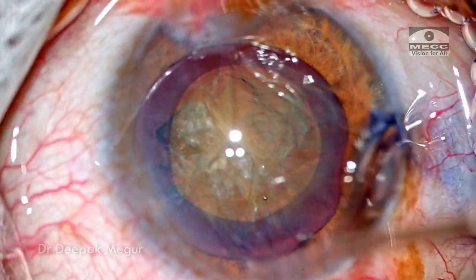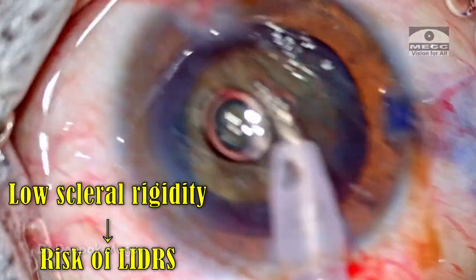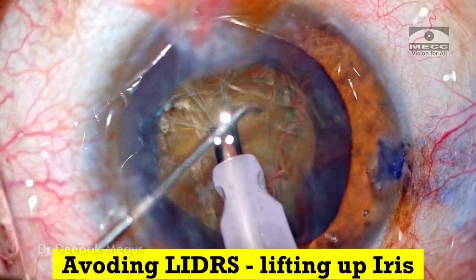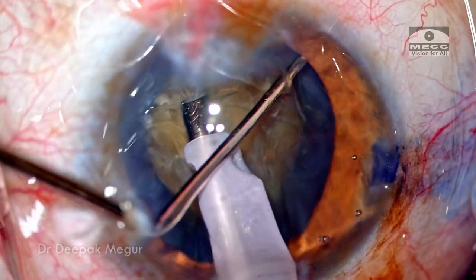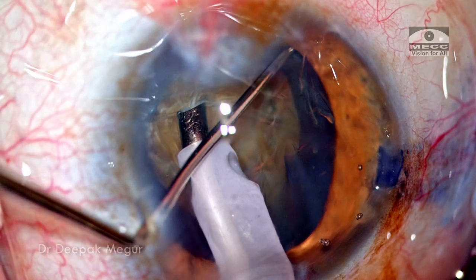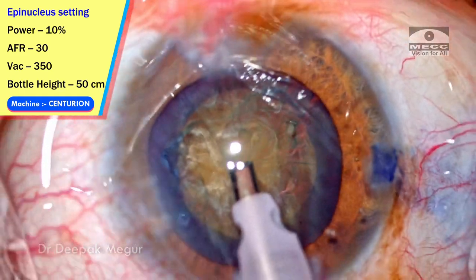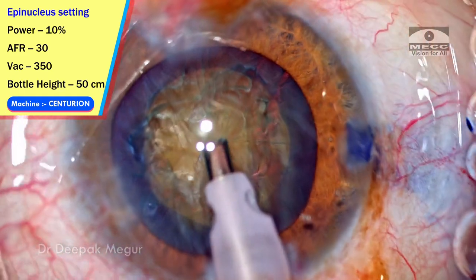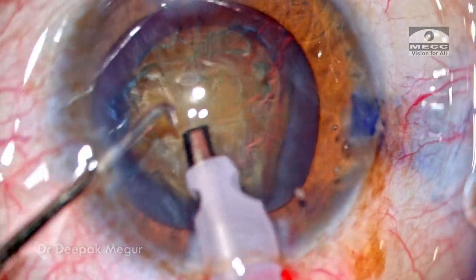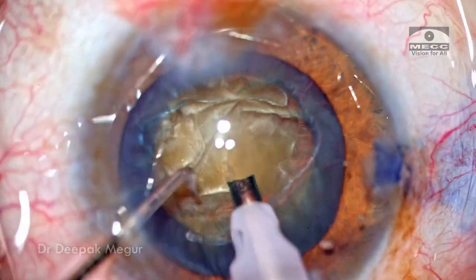Time to emulsify the nucleus. This is an eye with pathological myopia — these have typically low scleral rigidity and there is a risk of lens-iris retropulsion syndrome. To prevent this, before starting the infusion I go in with my dialer and lift up the iris, and then the infusion is started. This maneuver minimizes the sudden deepening of the chamber caused by the iris folding back and causing something like a reverse pupillary block. The bottle height is kept slightly low as we enter the eye. These two maneuvers — lowering the bottle height and lifting the iris before starting infusion — help prevent sudden deepening of the chamber in pathological myopic eyes.